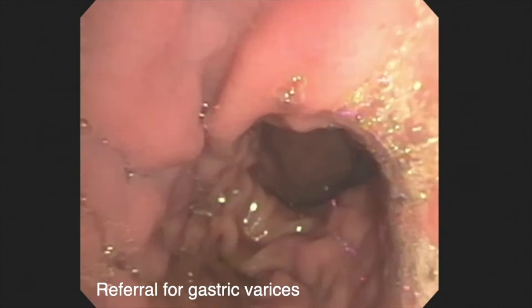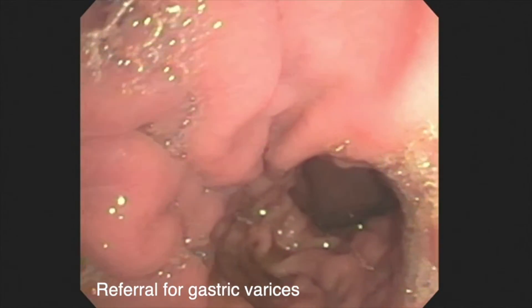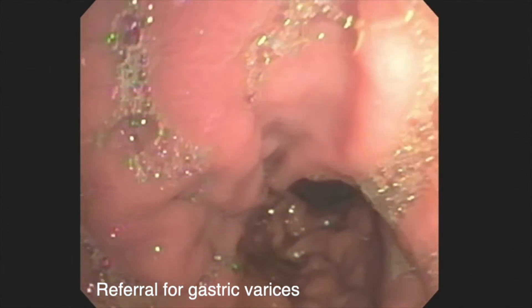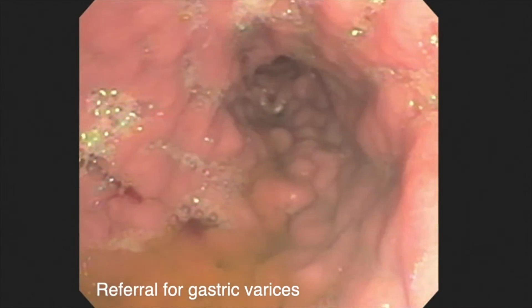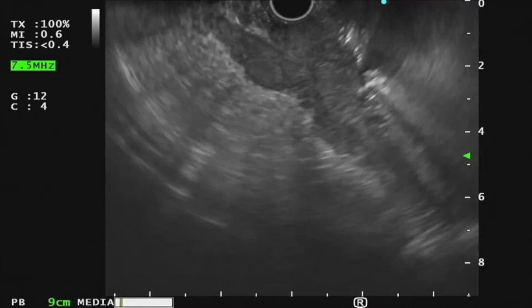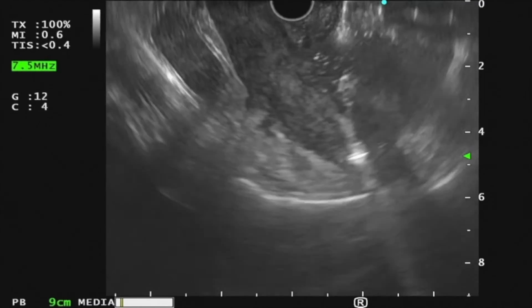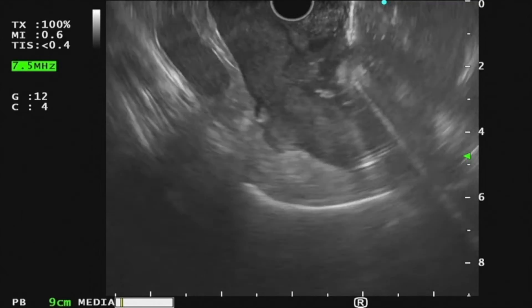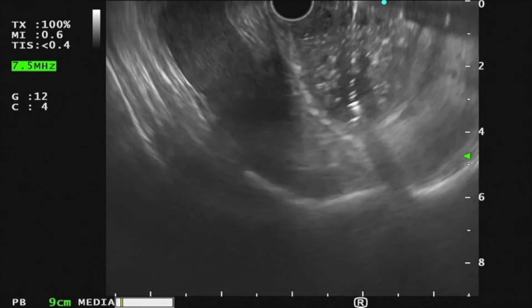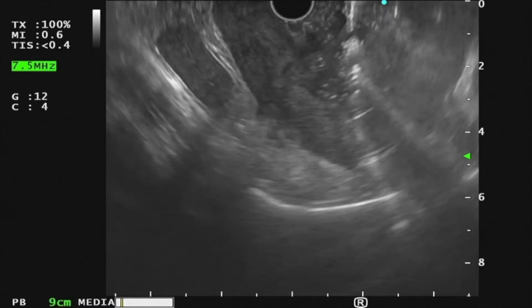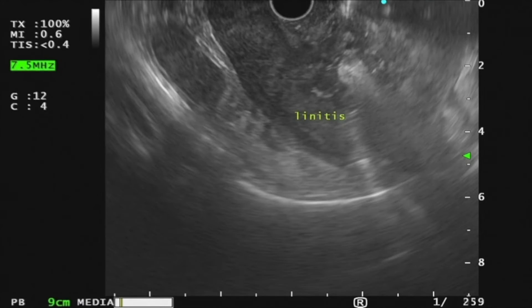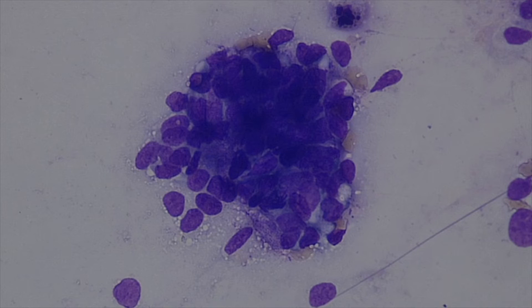This 46-year-old patient with liver cirrhosis was referred for suspected gastric varices. On EUS, a diffuse hypoechoic mass was seen with involvement of all gastric wall layers, suggestive of linitis plastica. Fine needle biopsy of the gastric wall revealed adenocarcinoma.